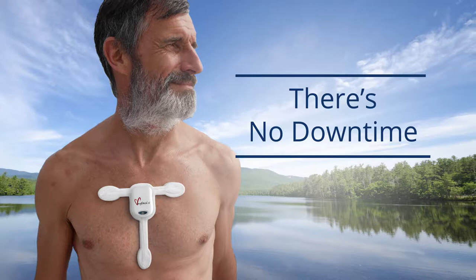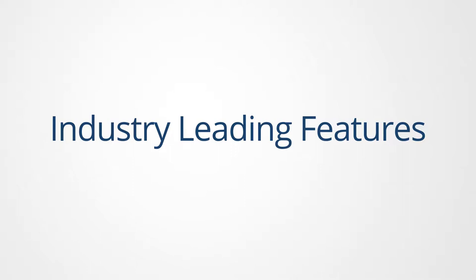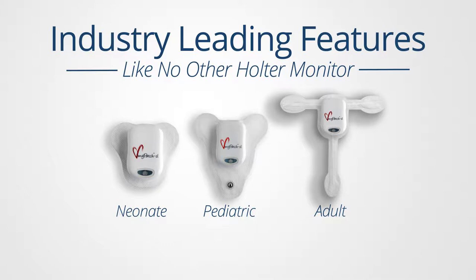There's no downtime waiting for the electrode to adhere to the body. MyPatch SL offers industry-leading features that no other Holter on the market can. Three unique electrode sizes allow the perfect fit for any patient: neonate, pediatric and adult.